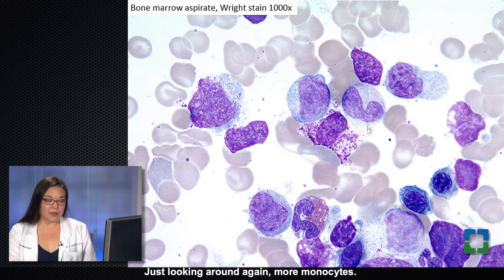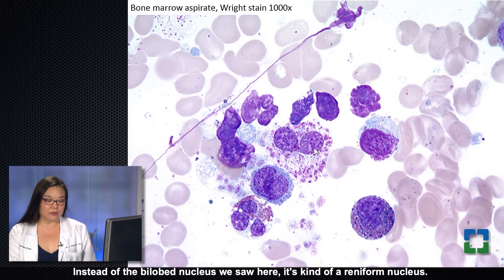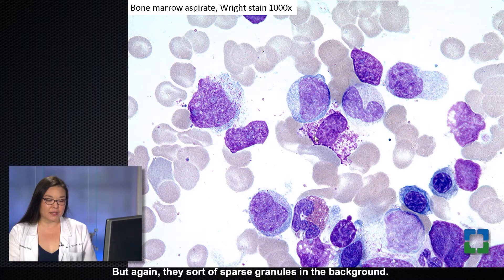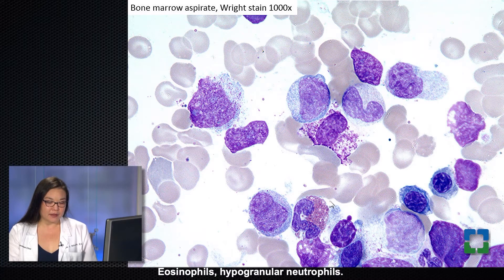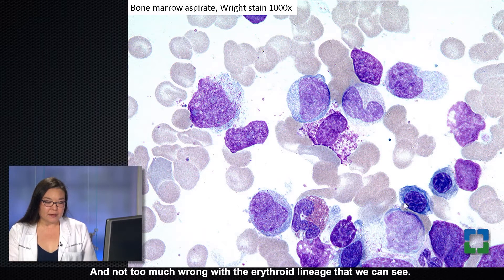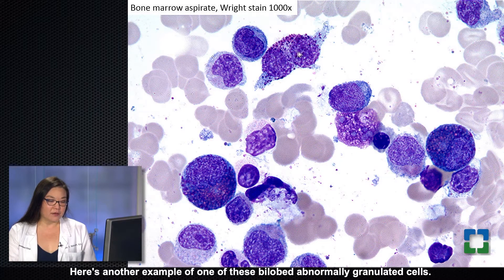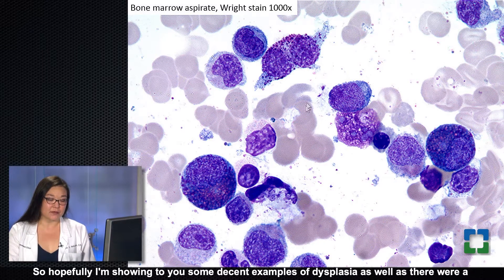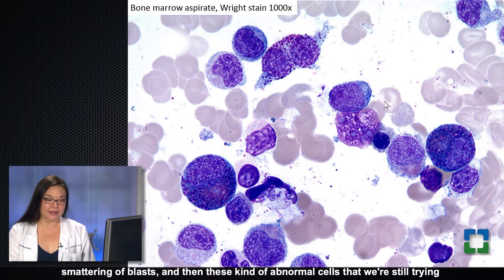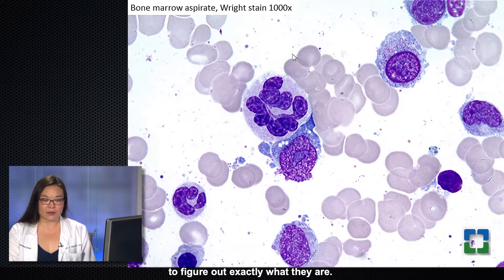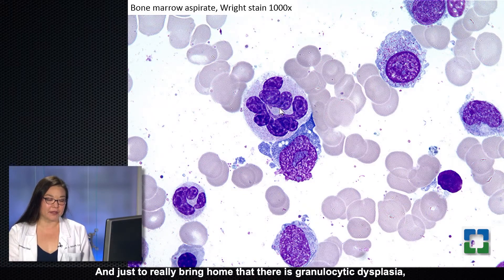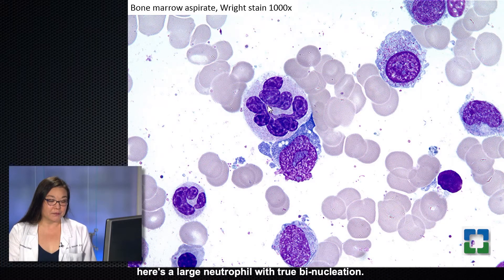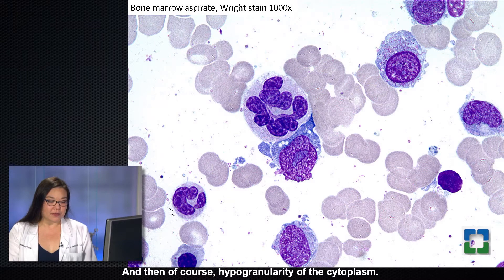Looking around again, we see more monocytes. Here's another one of these atypical cells — instead of a bilobed nucleus, it has a reniform nucleus with sparse granules in the background. There are also eosinophils and hypogranular neutrophils, with not too much wrong with the erythroid lineage. Here's another bilobed abnormally granulated cell, another eobazo, hypogranular neutrophils, and abnormal monocytes. To really bring home that there is granulocytic dysplasia: here's a large neutrophil with true binucleation and hypogranularity of the cytoplasm.